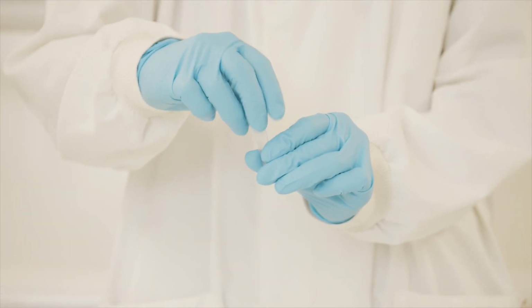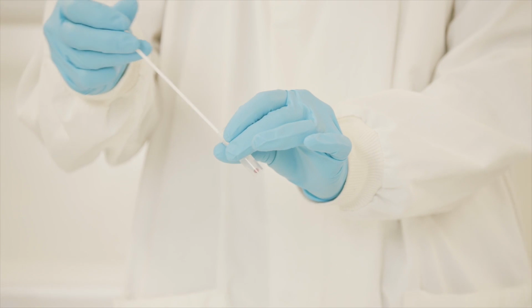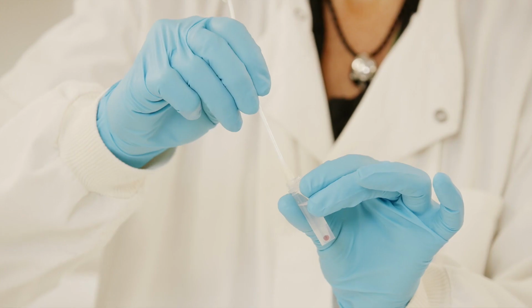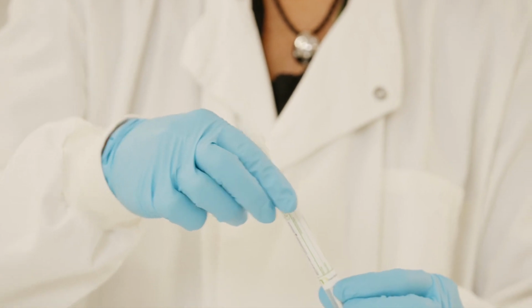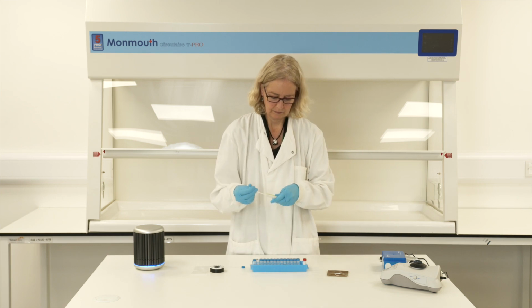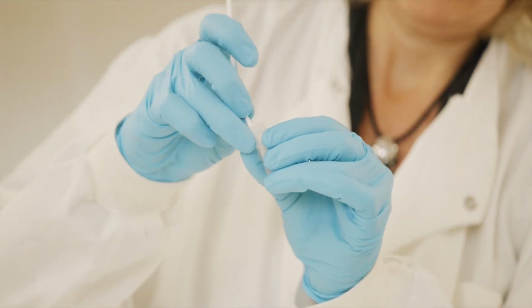If this is being performed in a Class 2 safety hood, the swab can be inserted into the buffer and twirled to release the biological material. Press the swab against the side of the tube upon removal and safely discard. If this is being performed outside of a Class 2 hood, then the swab must be placed carefully into the buffer tube and snapped off to enable the tube to be capped.